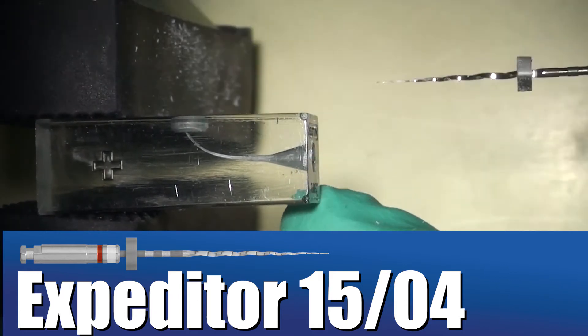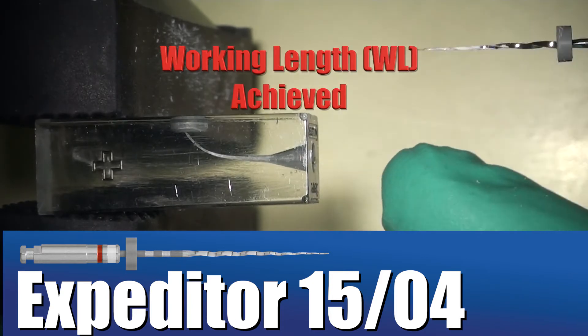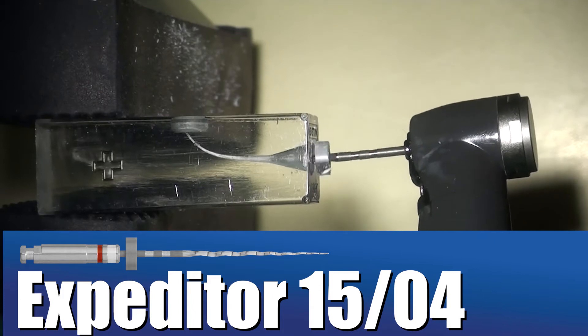An advanced canal is any canal where a 1502K has difficulty getting to working length. In basic canals where a 1502K easily gets to length, you'll go straight to the Shaper.